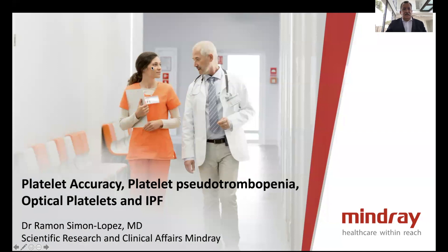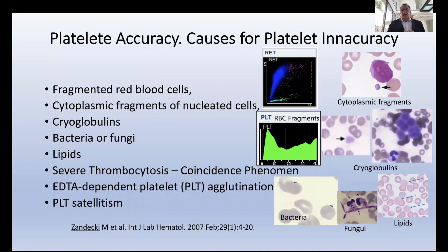Platelet accuracy and causes of platelet inaccuracy: one of the more common causes is fragmented red blood cells that can interfere with platelet counting. As you can see here in the center, there is a histogram of a case with fragments where the red cells enter the area of platelets, and we don't know if these are really red cells or platelets.